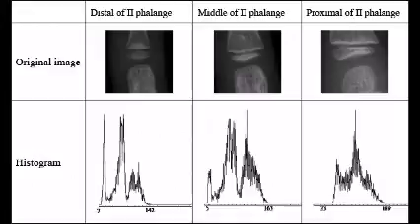After it's done scanning, a histogram is created. A histogram identifies all densities on the IP in the form of a graph. Graphic representation appears as a series of peaks and valleys and has a pattern that varies for each body part. It's important to choose the correct anatomical region on the menu before exposing the patient. Raw data used to form a histogram is compared with a normal histogram of the same body part by the computer.